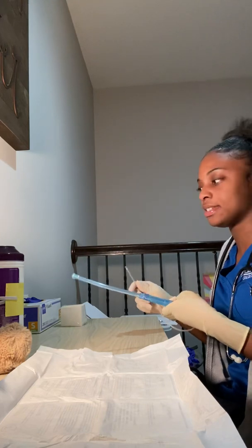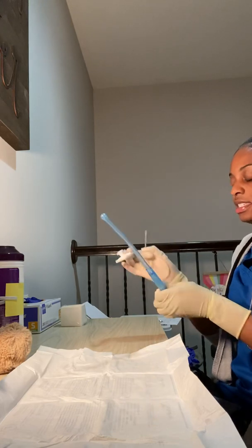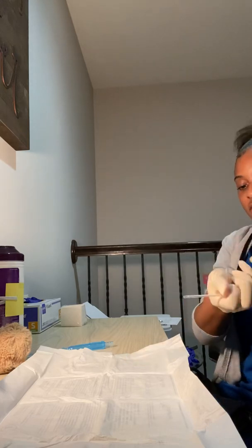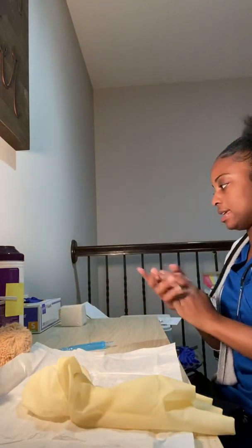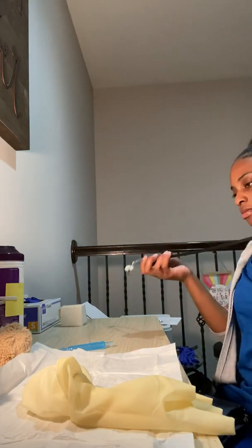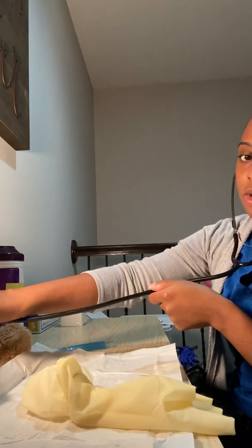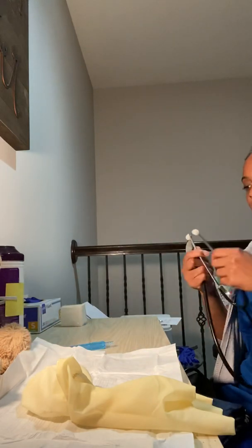I'm gonna go ahead and begin another respiratory assessment and assess her lung sounds again to see if they are clear. So I can discard of this in my gloves. This will be done. I'm no longer sterile. I can discard of the catheter in my gloves and take that off. Okay, so I'm gonna go ahead and wash my hands again. I'll put on regular gloves, perform another respiratory assessment. Do some lung sounds again. And she sounds much clearer now.